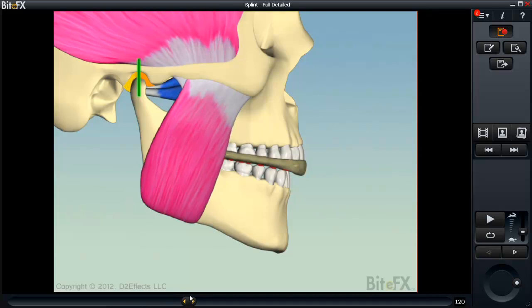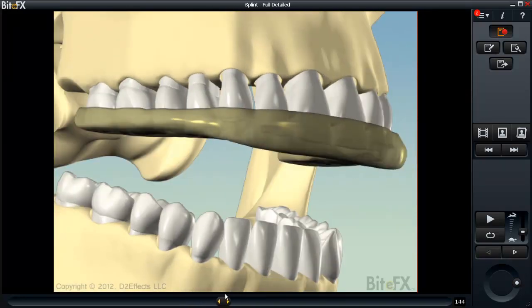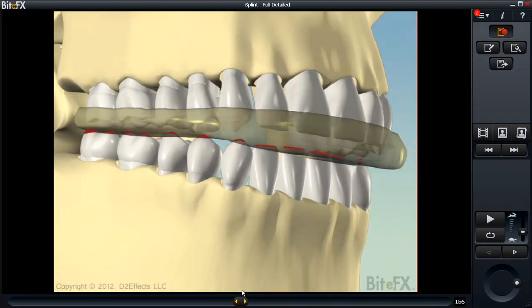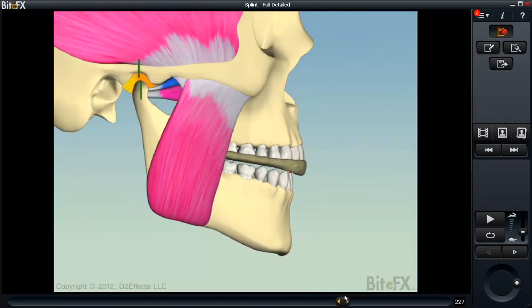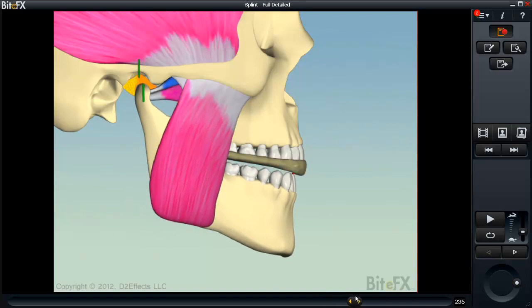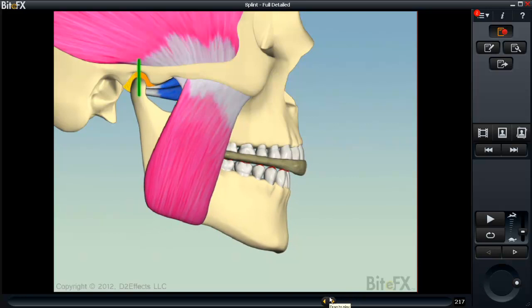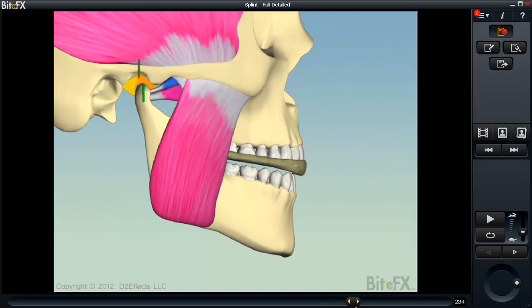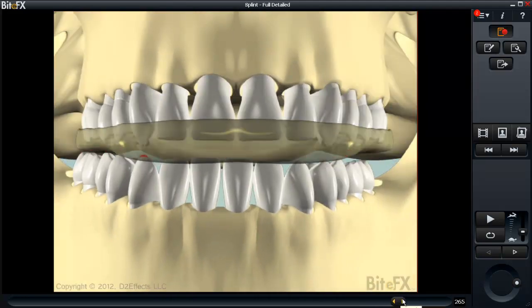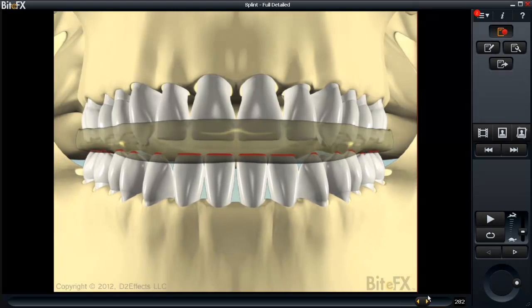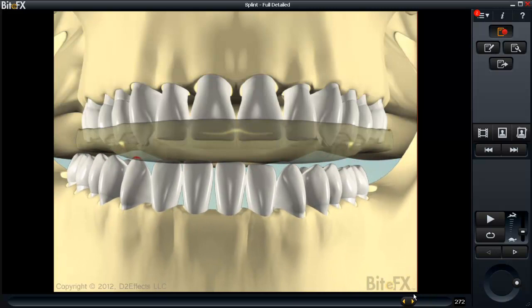Here we're showing just the elevator muscles — the mouth-closing muscles — functioning. I also have an opportunity to show them that this appliance requires proper tooth contact: just little lines in the front and dots in the back, with all teeth hitting simultaneously. And finally, if they slide forward, the front of the appliance separates the back teeth. When they close, the joint seats and the pterygoid muscles relax. If they were to move sideways, just the canines touch whether they move right or left — I'll go back and forth and let them see that canine guidance.